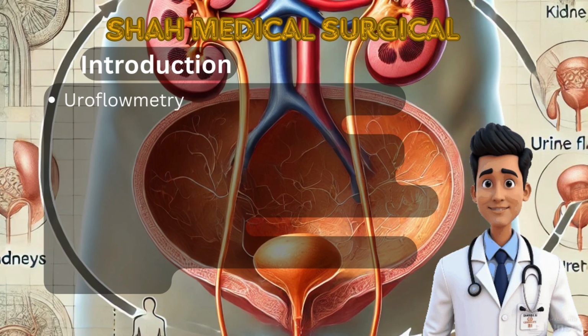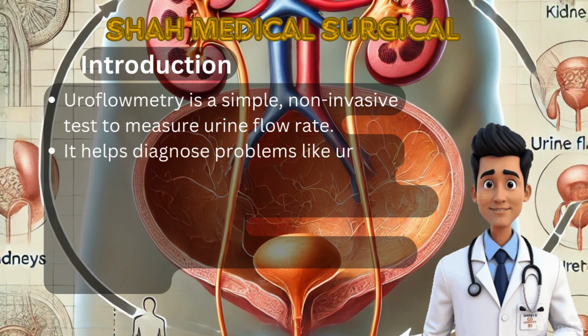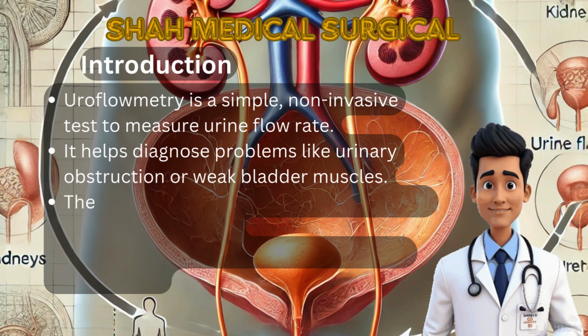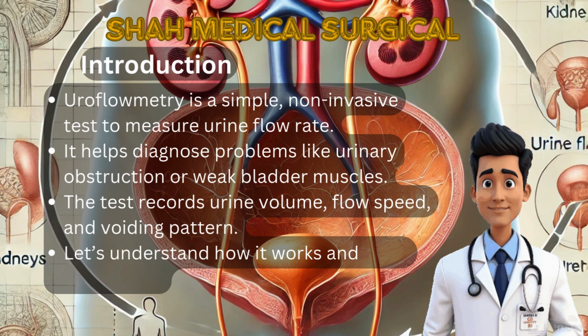Welcome to this informative video on uroflowmetry, a simple yet essential test for assessing urine flow. This non-invasive test helps detect urinary issues like blockage or weak bladder muscles. By measuring urine volume, flow speed, and voiding patterns, doctors can diagnose underlying conditions. Let's explore how the test works, who needs it, and what the results mean.